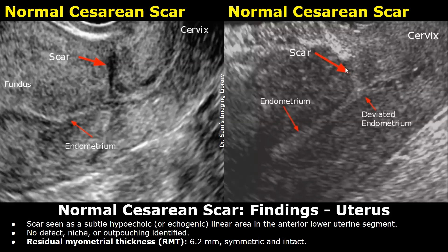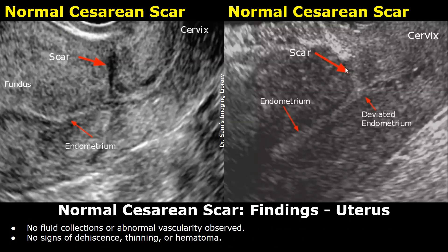Residual myometrial thickness (RMT) measures 6.2 mm, symmetric and intact. No fluid collections or abnormal vascularity observed. No signs of dehiscence, thinning, or hematoma.